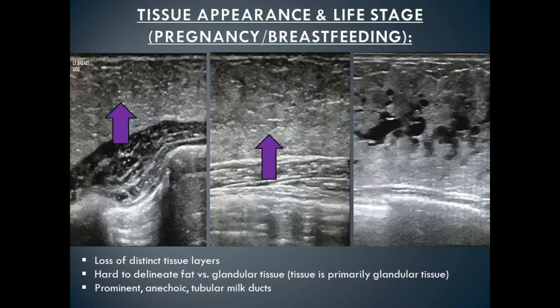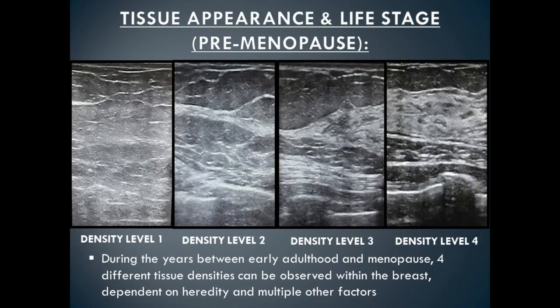The most characteristic feature during pregnancy and breastfeeding is the loss of distinct tissue layers. Although the tissue appears grayish in color, it's actually all a thick layer of glandular tissue. As breastfeeding occurs, you start to see anechoic tubular structures, which are the milk ducts within the tissue. You can no longer define glandular tissue versus fat.